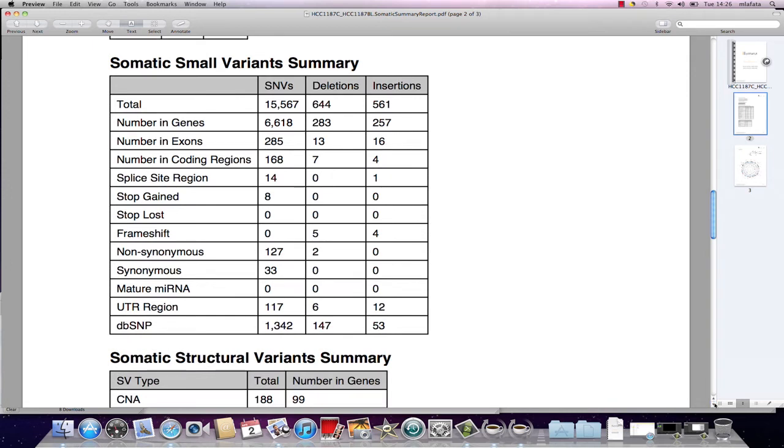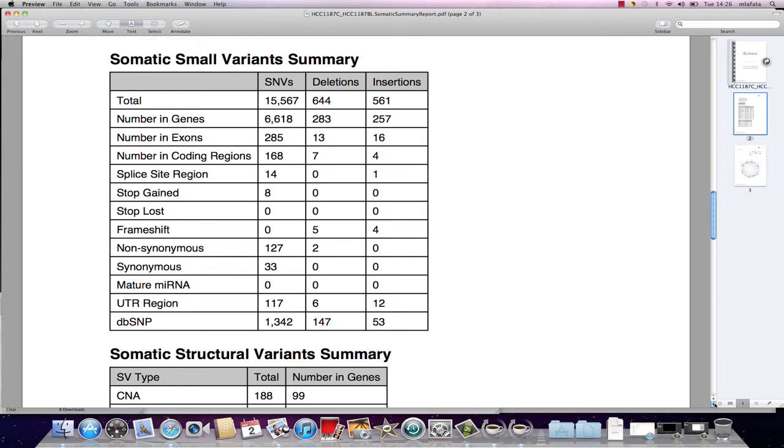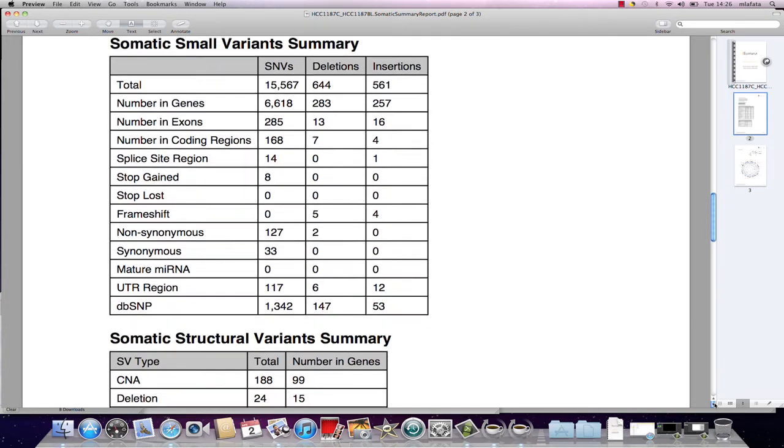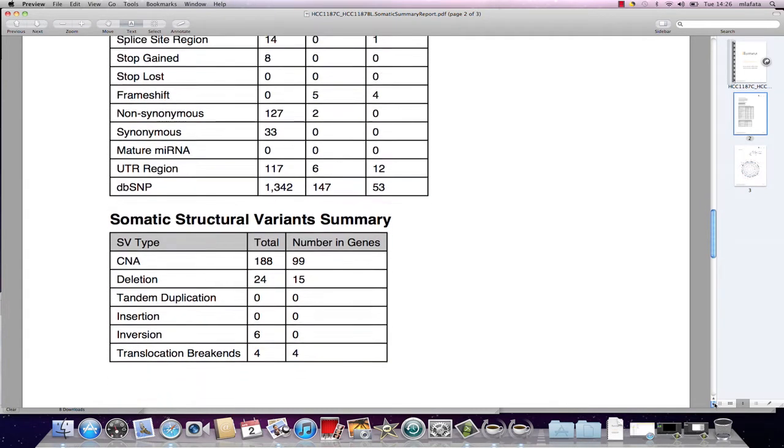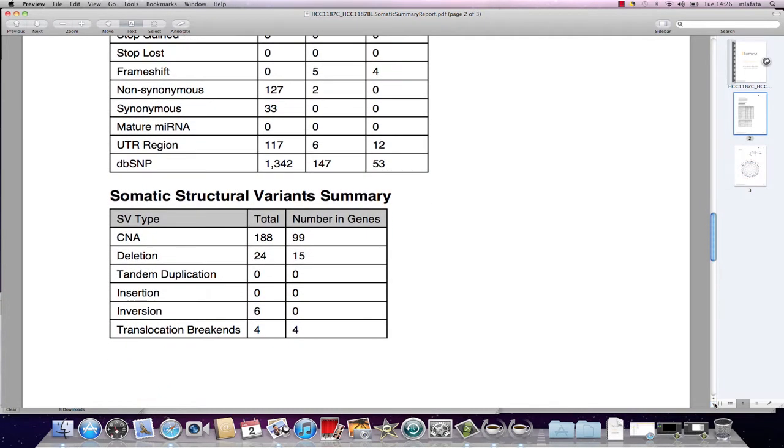The small variants summary shows all of the small changes found. The structural variants summary shows larger changes found, including copy number aberrations and translocations.